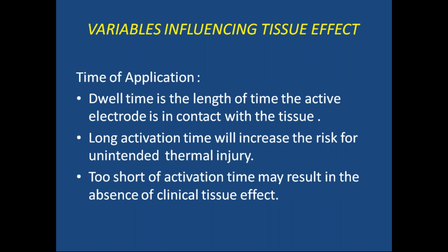Coming to time of application, dwell time is the length of time the active electrode is in contact with the tissue. Long activation time will increase the risk of unintended thermal injury. So minimal, short pulse activations should be used. At no stage should you apply the current to the tissue for a long time; we should apply it in short pulses only.